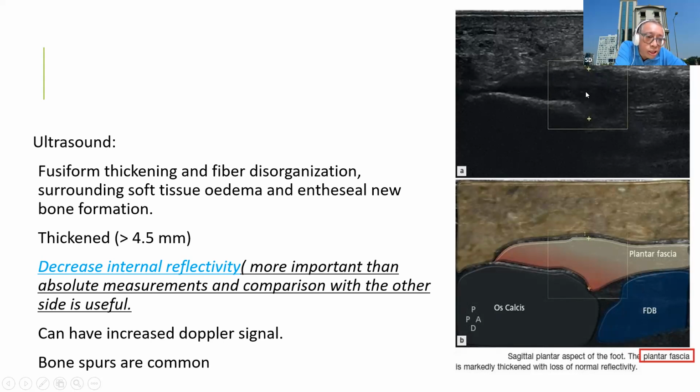So where there is maximum enlargement, or at the beginning of the calcaneum, this is the area where you should measure. Okay, or where there is maximum thickness, this is the area where you should measure the thickness of the plantar fascia. And another thing you should know is, sometimes the thickness of the plantar fascia can be normal, but still the patient can have a heel pain.